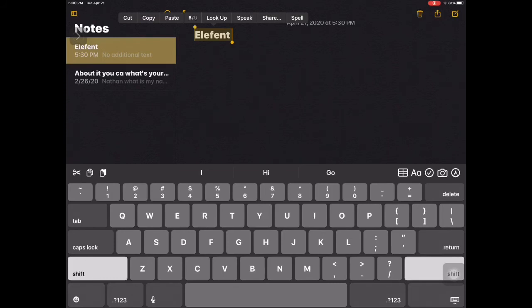So this option may not be ideal for communicating all the time, and it's definitely not going to work for all clients. However, it does work, and especially in a pinch, it gives someone a way to speak and have their voice. So that's speech selection.